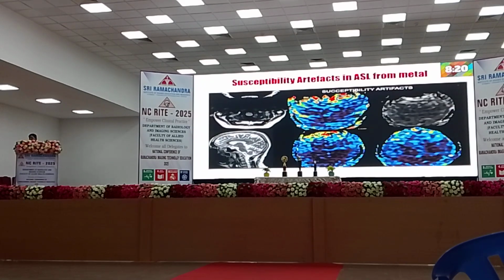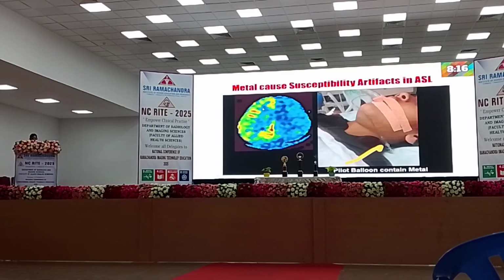Another example is this susceptibility artifact, because of the metal. The third one, you can see this. We are facing this in ICU patients every day. So always you have to check all the patients, for example the pilot balloon contains metal.